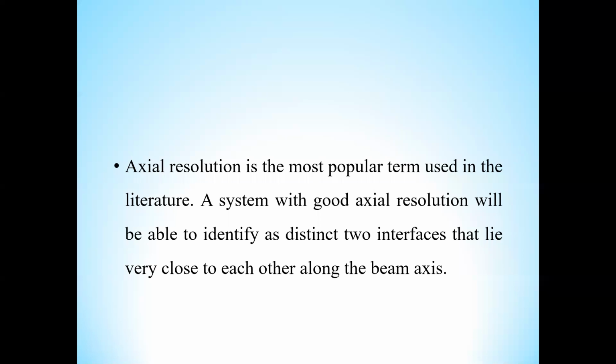So for the achievement of better axial resolution, we have to use the highest possible frequency, because there is a trade-off between frequency and penetration. When we increase the frequency, the penetration of sound wave in the body or in the soft tissue decreases, and vice versa.